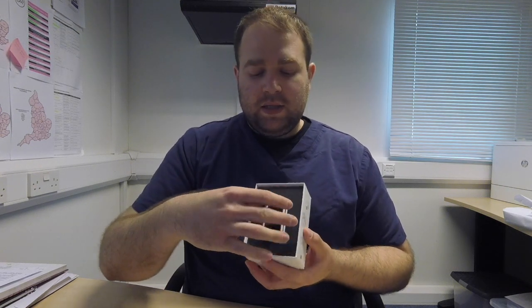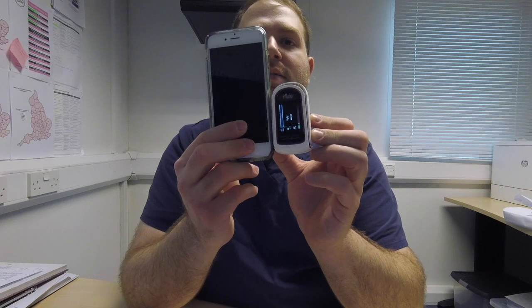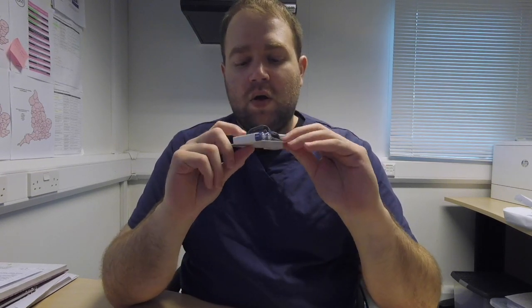So let's have a look at the device. As you can see, in the box you have the device itself — and that's pretty small. Let's compare it with my iPhone 6s — it's very, very small. Inside the box you'll also find an instruction manual. Never forget to read it. There are two batteries, a bag to carry it around, and a wrist or necklace strap.